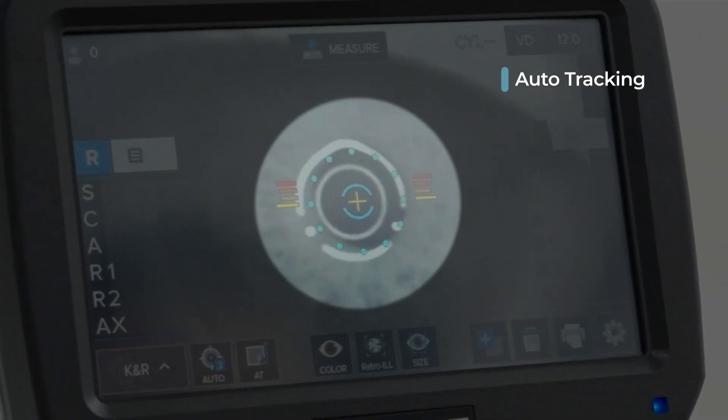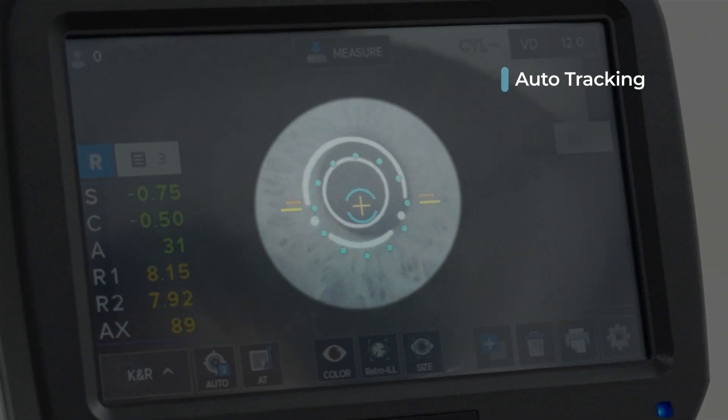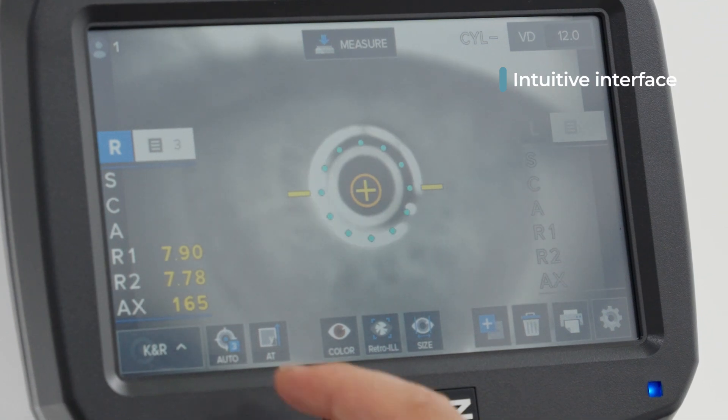The auto-tracking function automatically tracks the subject's eye from the moment it appears on the screen. And the intuitive, icon-based interface makes it easy for beginners to use like a professional's.